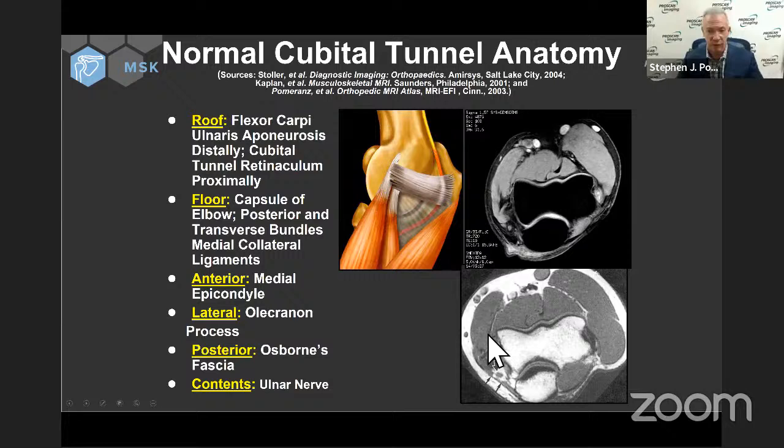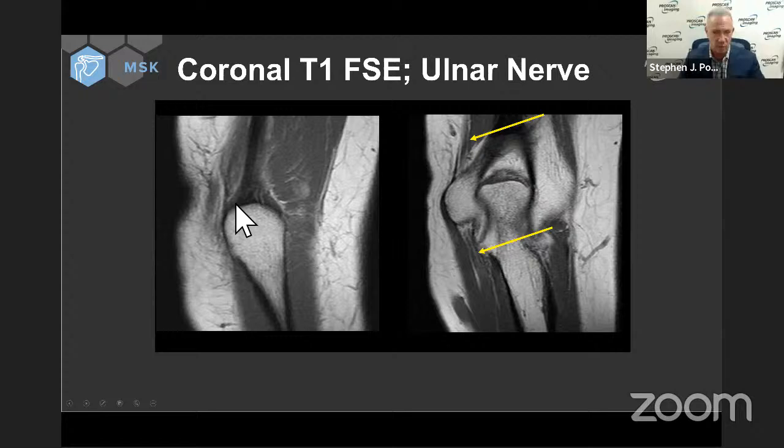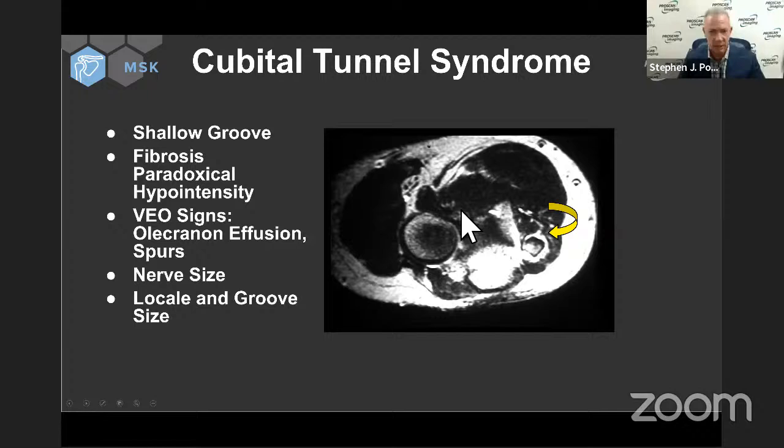Here's a coronal look at the elbow. There's your triceps tendon with its fan-shaped attachment. And there is your ulnar nerve. It should be pretty uniform in its size. Maybe it'll flatten out a little bit when it goes behind the condyle. It shouldn't go from dark to white to dark. And on a T2, it should maintain a uniform intermediate signal intensity. It should look nothing like this.